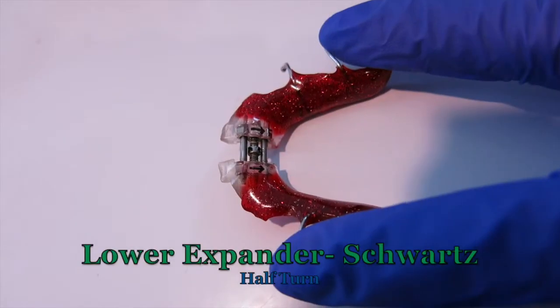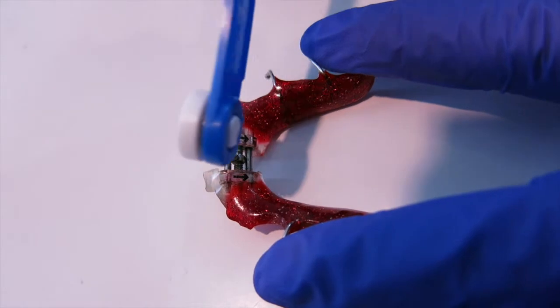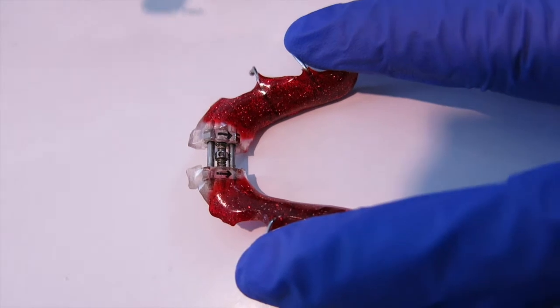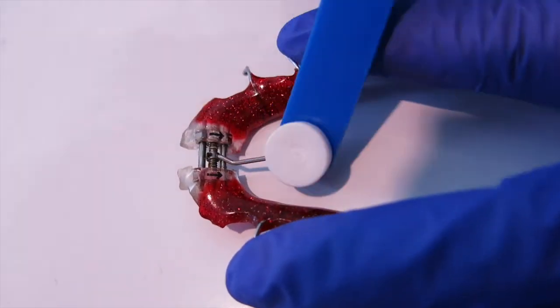Now I'm going to teach you how to do a half turn. Take your key and place it in the hole closest to the front and bring it to the middle. That's a half turn. To continue for the next day, take your key and place the key into the hole in the middle and bring it all the way to the back.